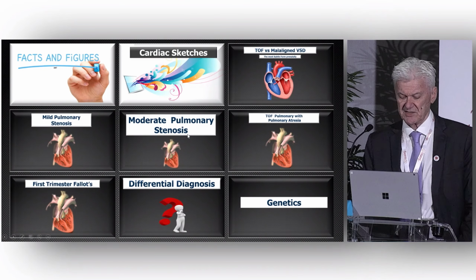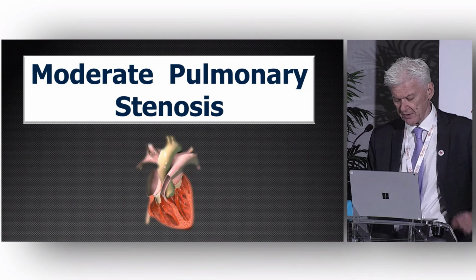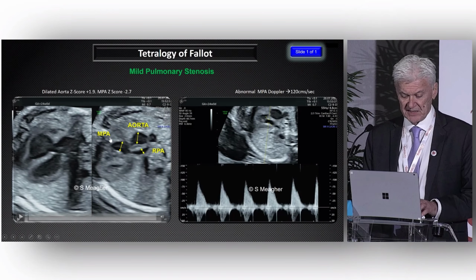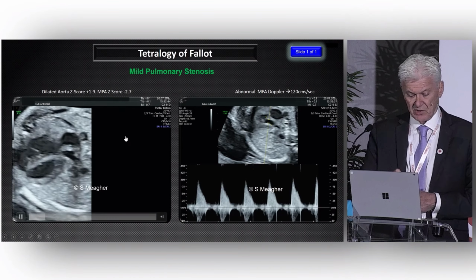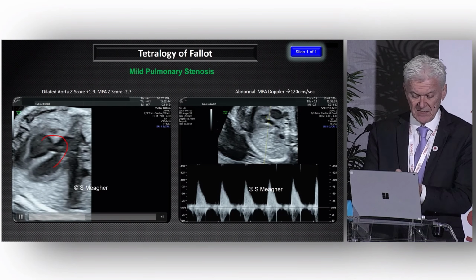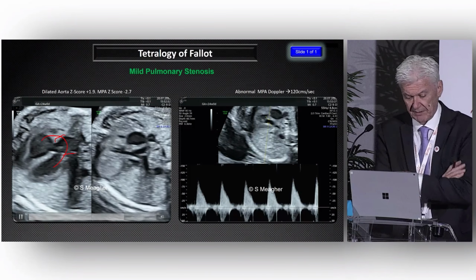These, however, are the cases that we're all familiar with. I've just shown you a list of challenging ones. Nobody will dispute a diagnosis of Tetralogy of Fallot, and you can see I'm Z-scoring the main pulmonary artery, I'm Z-scoring the branch pulmonary artery, and I'm Z-scoring the aorta in a baby who's 24 weeks of gestation. You can see that there's aortic override, there's dropout, edge enhancement. The aorta is less than 50% across, and therefore it's a Fallot's, not a double outlet.